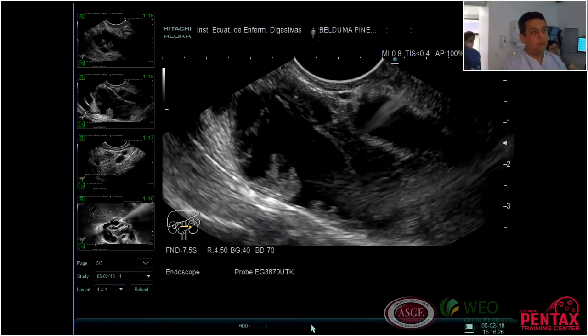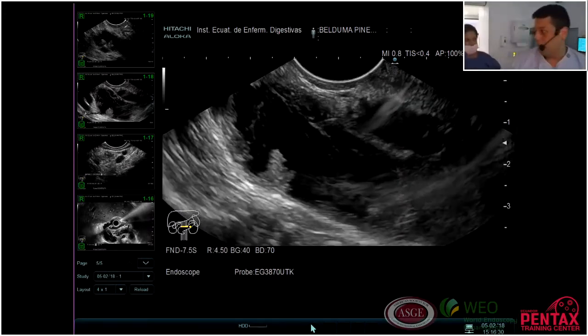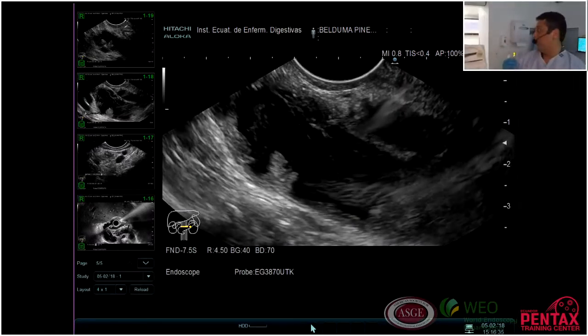Okay, so we will start with our fine needle puncture.